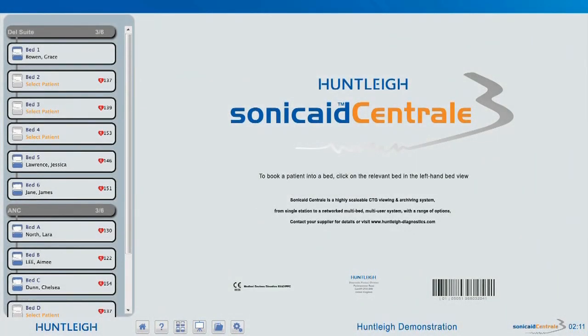Welcome to Sonocade Central 3. Down the left-hand side, we can see the beds and patients that have been allocated. This bed bar is always visible showing alerts, patient and bed information. This page is the home page and can be selected by clicking the home icon. We are being prompted to add the patient details to beds 2, 3 and 4.